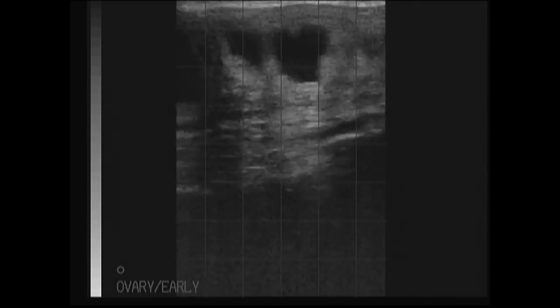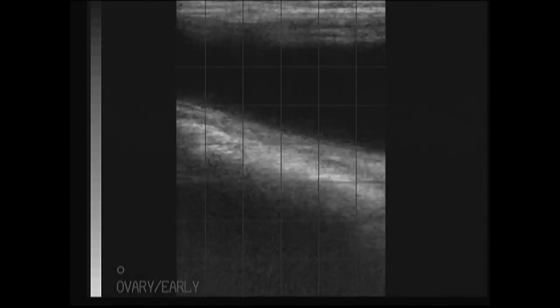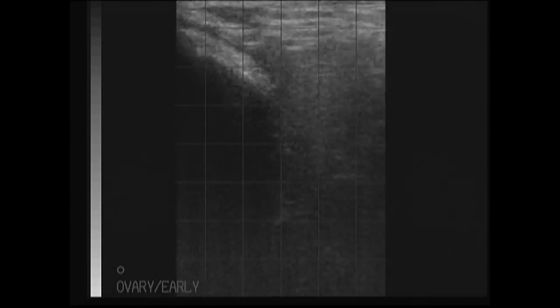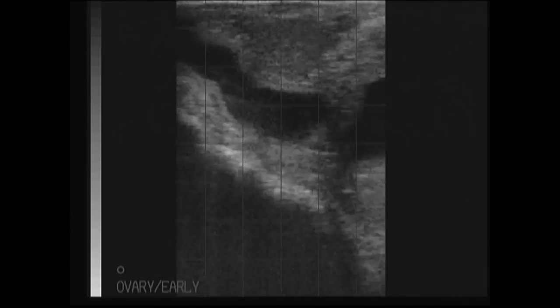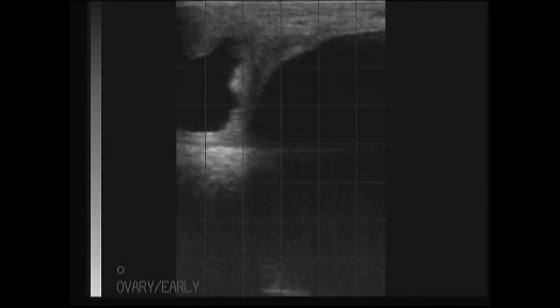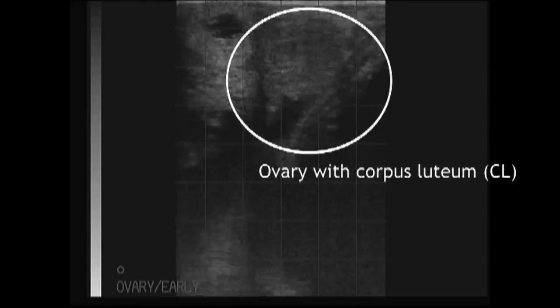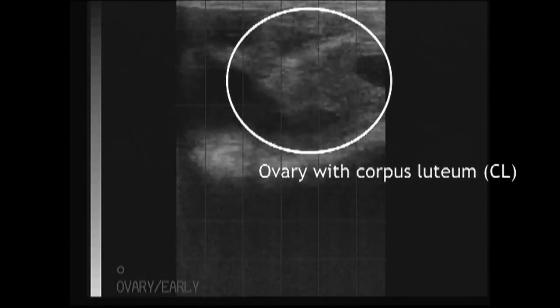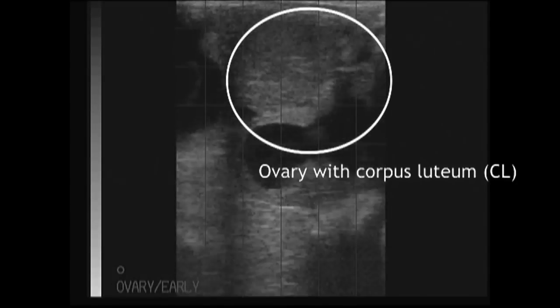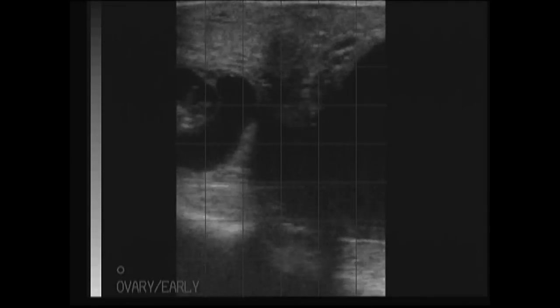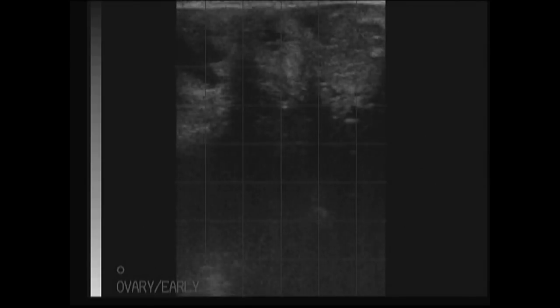We will then continue back down the horn and up the other uterine horn. At this stage the other ovary comes into view with the presence of a corpus luteum, which is a gray, homogenous, smooth-appearing structure on the screen.